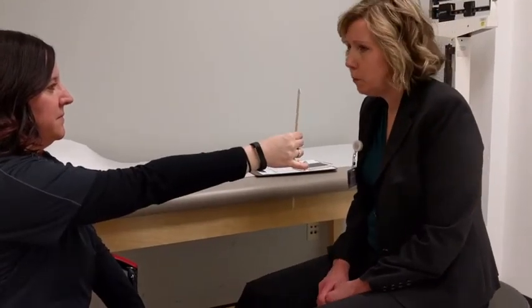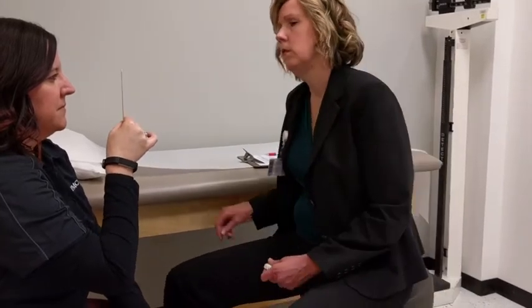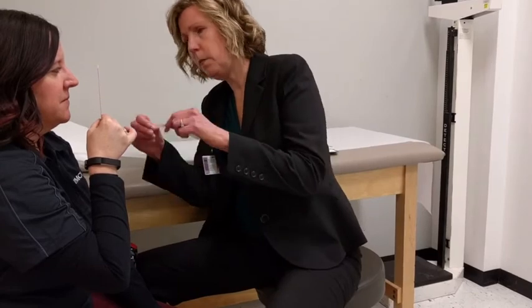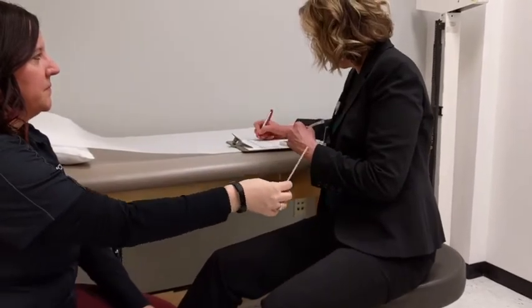All right, take it all the way out. I'm going to have you do that again. Bring it all the way in towards you. Stop if and when it splits into 2. Bring it up there. So I'm going to measure that point. That is 4 centimeters. All right.